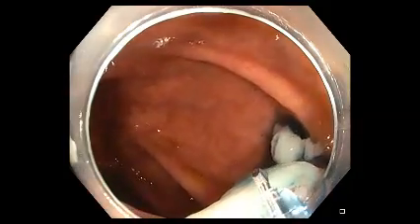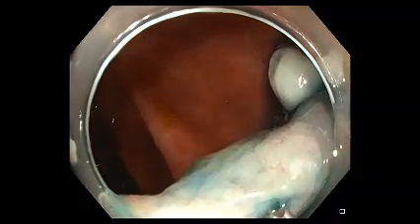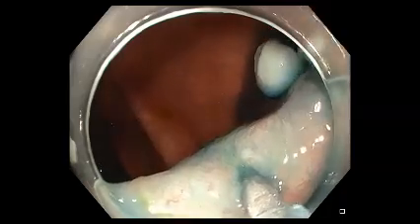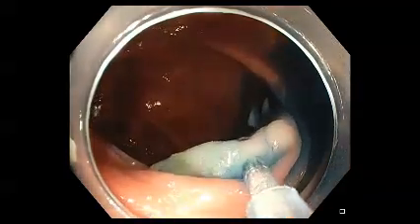Notice there is a small amount of polyp tissue from an adjacent polypectomy unrelated to this particular sessile serrated lesion. We inject the lesion typically beginning on the backside first, working towards the front side of the lesion or the side nearest the endoscope. We inject sufficient fluid in order to entirely lift the polyp plus a small amount of lifting adjacent to the lesion.